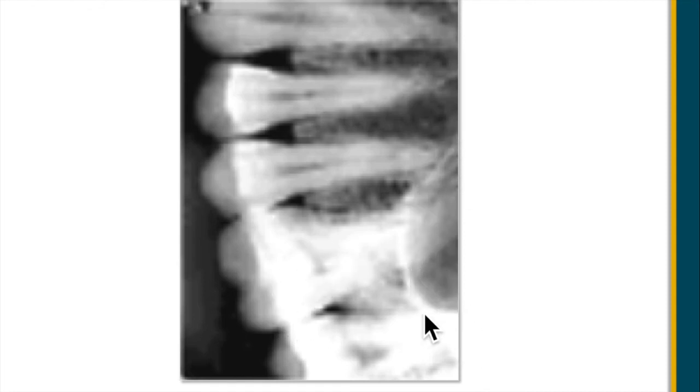Here's the floor of the sinuses, so you know this is going to be a maxillary tooth. Number 14, 13, 12, 11, 15.